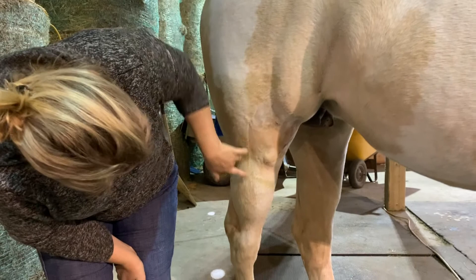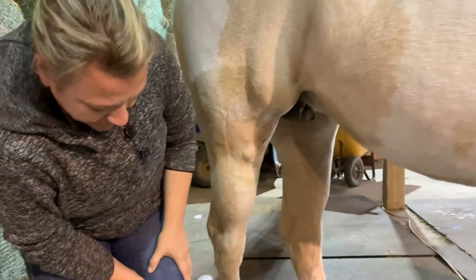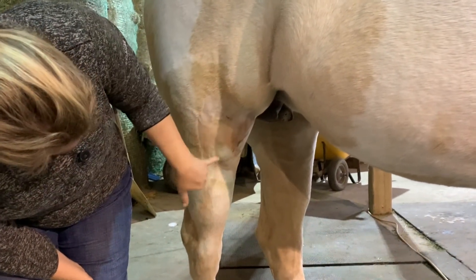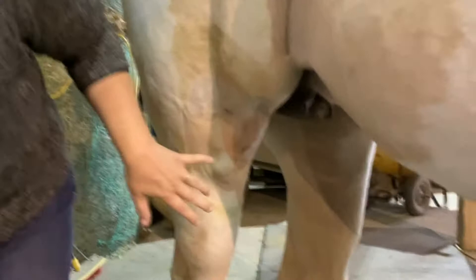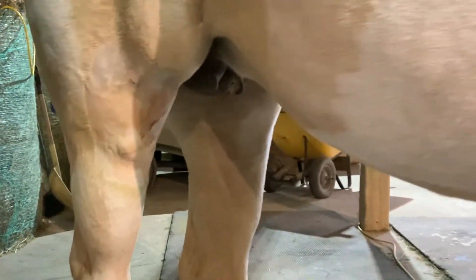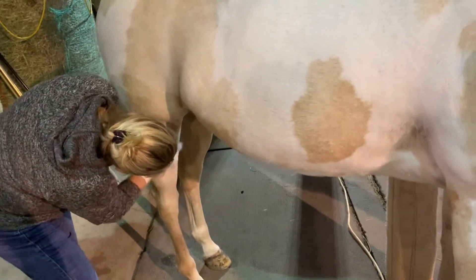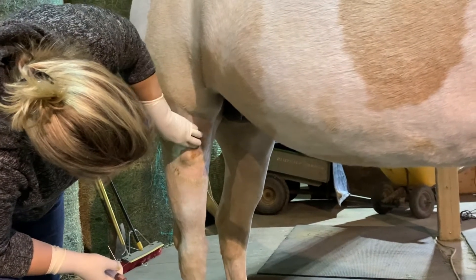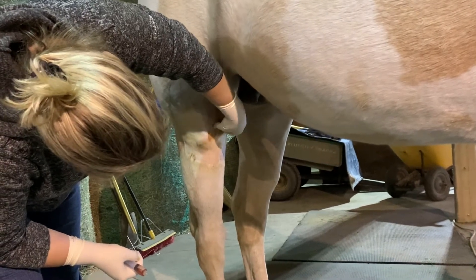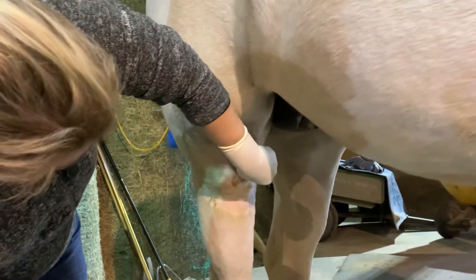We just did a rough scrub on this area. I like really big margins because if the horse moves or pops her knee forward, you will still not compromise sterility. This horse has an injury, so there's a lot of scar tissue I have to avoid. I'll come in with my sterile gloves and do a sterile prep to keep everything on the surface completely sterile. I find the patellar ligament, and I know from before that this horse has hardly any joint fluid in here.